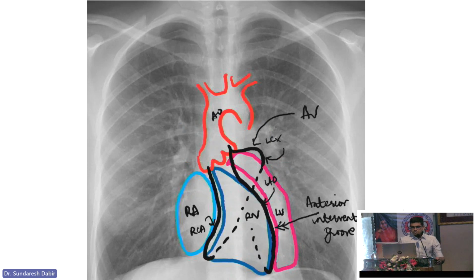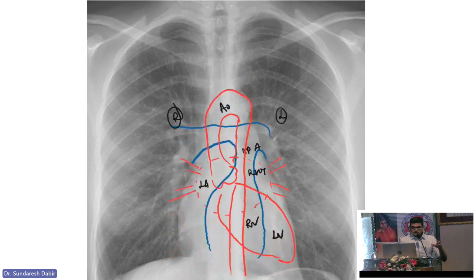If I take another image, the same thing. So that was the coronaries. This is the arterial circulation and the LA. If you can see, the RV is like an oblong structure. So you have a RV, then RVOT, and it opens into the PA. And how is the LV oriented and how are the pulmonary veins oriented? This is how you should know, because somebody is doing an ASD, they're crossing the ASD. Many times the wire will go into the RVOT or the PA. How will you know they're in the pulmonary veins? If you're outside the cardiac silhouette, it's the pulmonary vein.